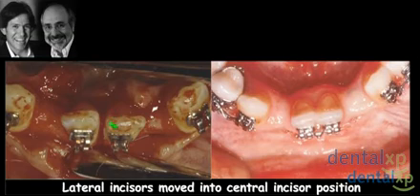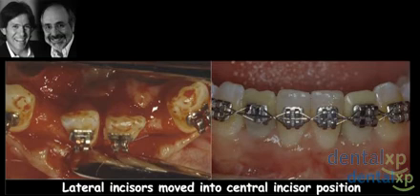The laterals are now centrals, and we can now put small diameter implants in the lateral positions. Now, this takes this case not only from a surgical standpoint, reconstituting the ridge, David, but now it turns it from a case where we would have required 2 adjacent implants, where we would have spacing issues, to 2 single implants that were placed in the previous areas of the lateral incisors.